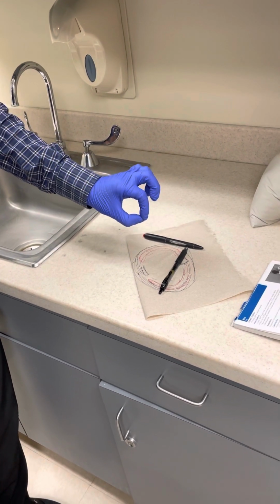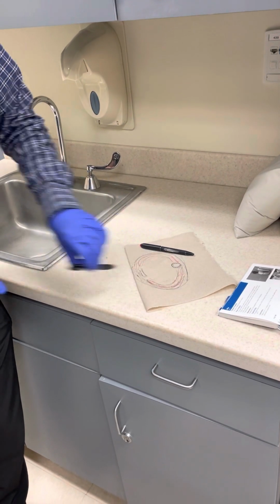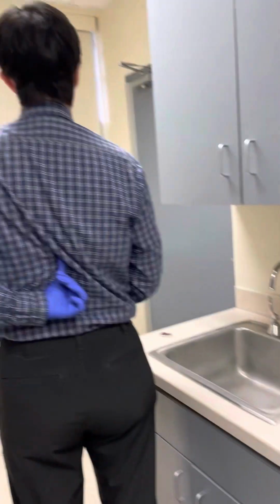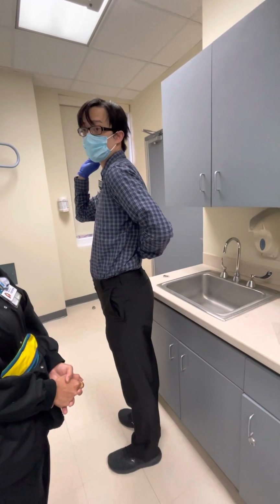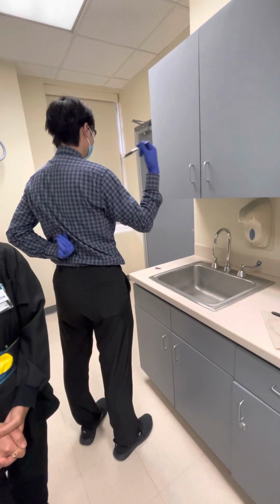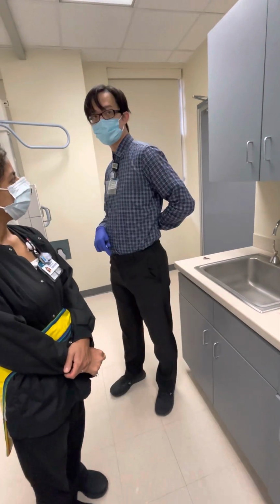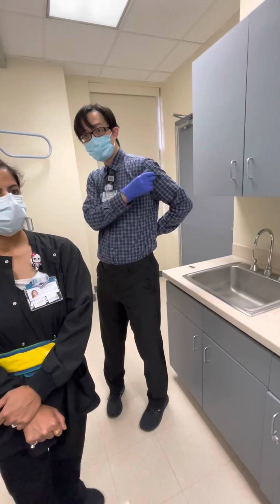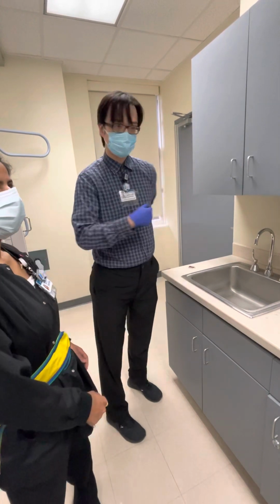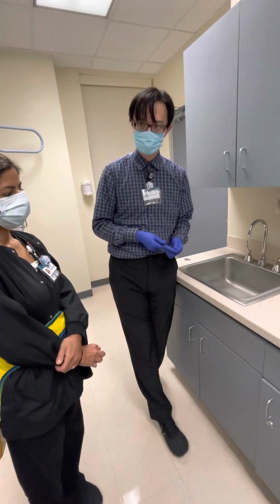So the key here is that we're looking at where the spine is not. Right? If you ever forget this, if you can't keep track of which one is which, just remember you're looking for where the spine is not going to be. Right? So you feel your spine, you're like, all right, I'm like this. I turn RAO. Okay, spine is going towards the right. It's going to be on the right side, so I want to be looking at the left ribs. Right? If I go LAO, spine moves towards my left, so I'm going to be looking at the right ribs. Right? If I'm doing this as an RPO, when I turn this way, my spine is going to the left, so I'm looking at the right ribs on my RPO. I turn this way, LPO, spine's moving towards the right, so I'm looking at the left side on my LPO. It's just all about where the spine is not going to be. Does that make sense? Right, great.